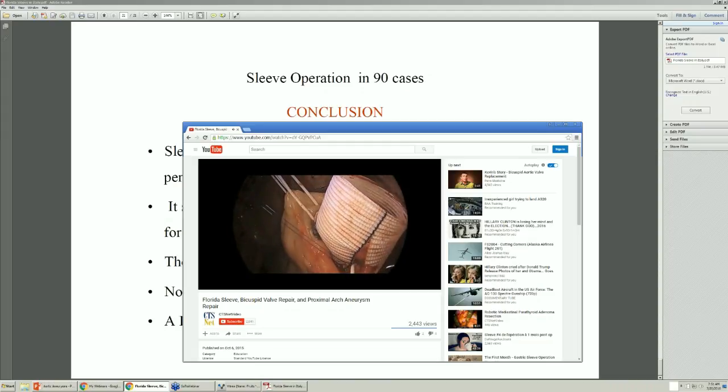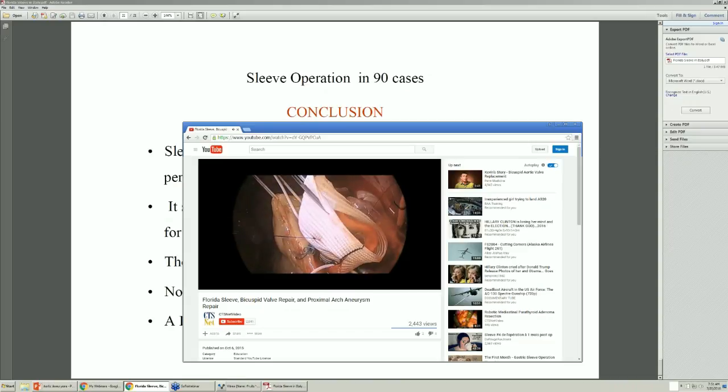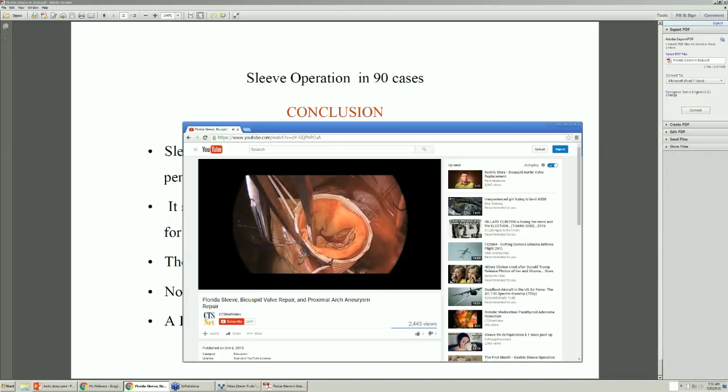Once we're finished closing the slits under the coronaries on either side, we're going to anchor the commissural areas of all three aspects of this bicuspid valve. The RN commissure is, of course, a bit lower than the others, and this is simply suspended at its anatomically correct location. Trimming any excess graft for the inclusion of the aortic root, and simply passing over and over proline sutures to complete the sinotubular junction anastomosis to the included aortic root.